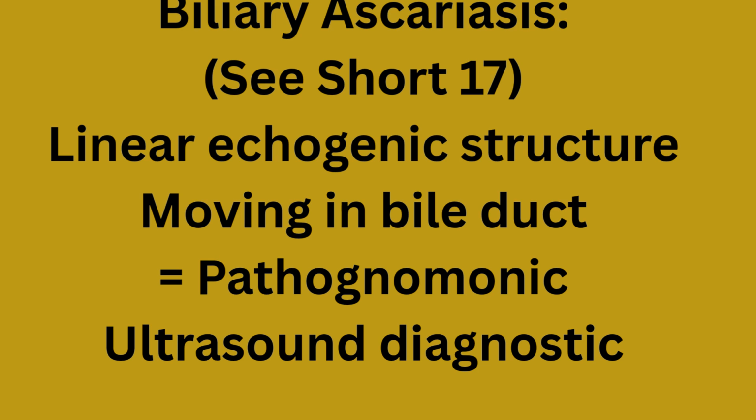Biliary ascariasis. Linear echogenic structure moving in the bile duct on real-time ultrasound. That movement is pathognomonic. Ultrasound is diagnostic. No other imaging is needed. For details, see shots 45 and 17.